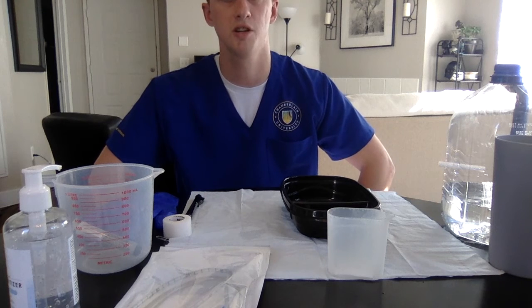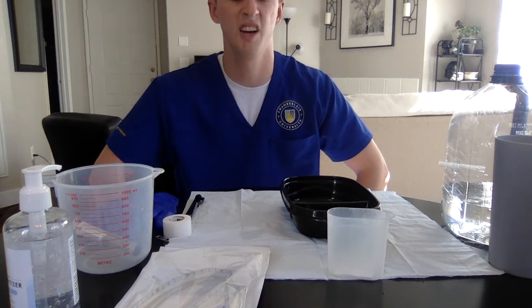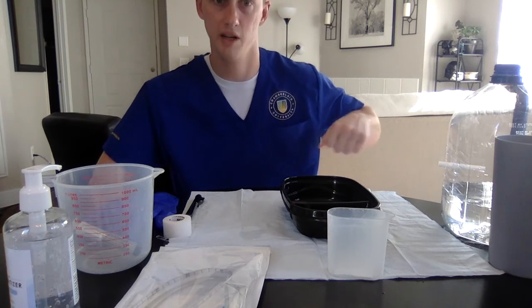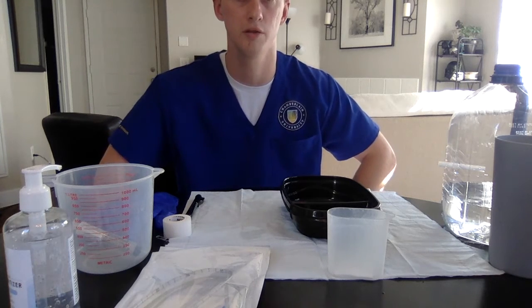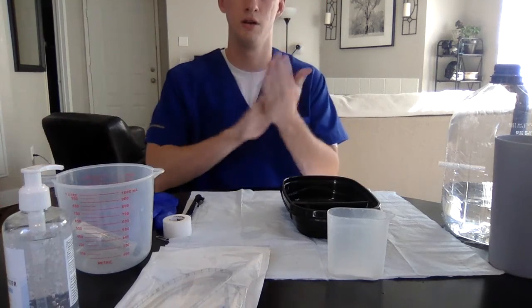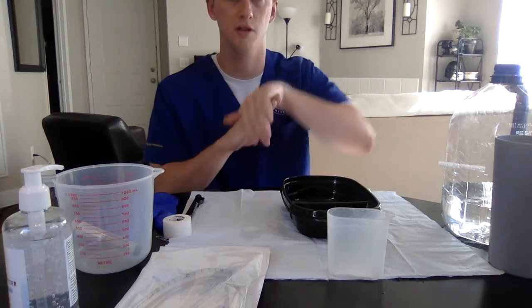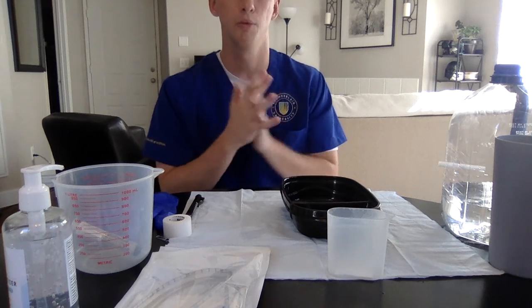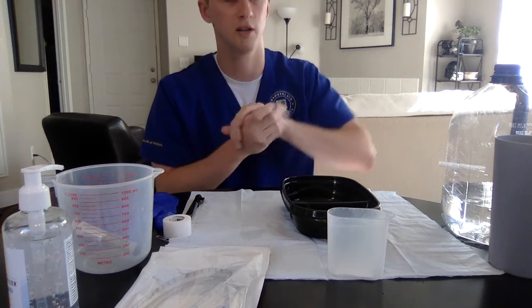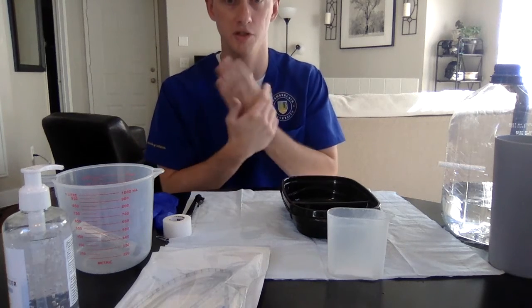We're going to make sure that our patient is sitting in the high Fowler position and that the bed is going to be at our waist level. We're also going to bring down the side rail on the side that we're working on over here. So we're going to perform our hand hygiene, and we're also going to auscultate the patient's lungs and bowel sounds. We're going to say that the bowel sounds are hypoactive, which allows for us to continue with our procedure here.